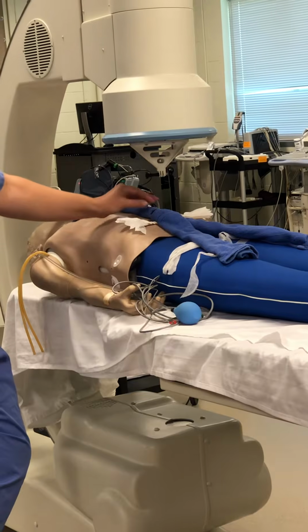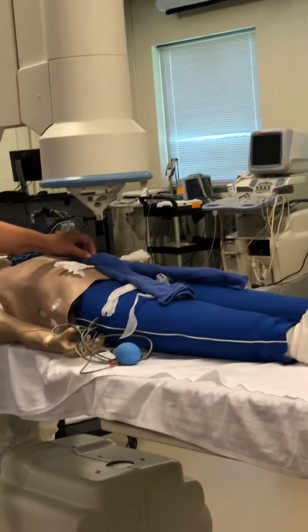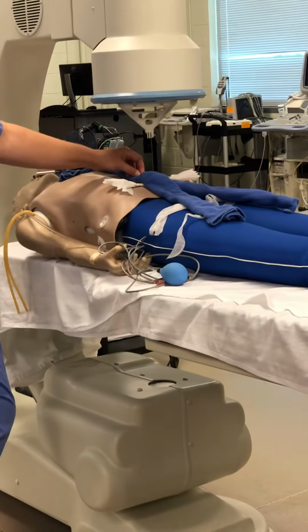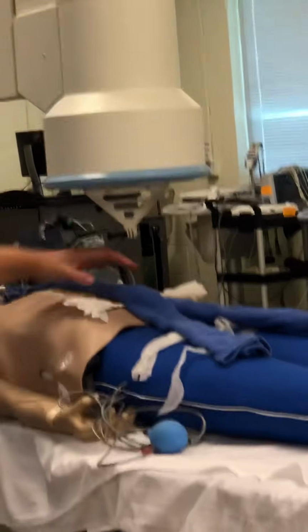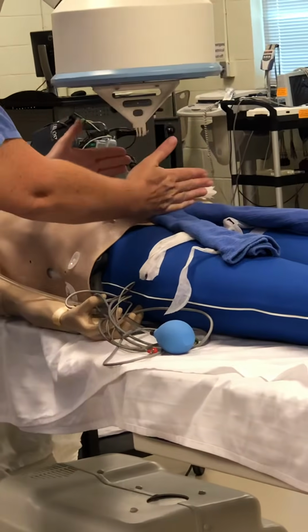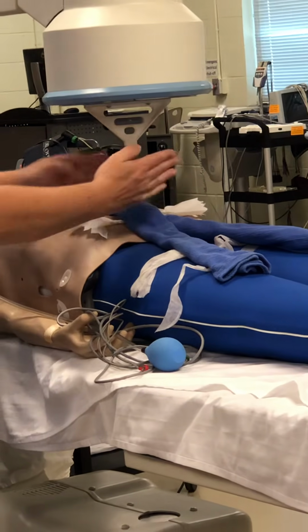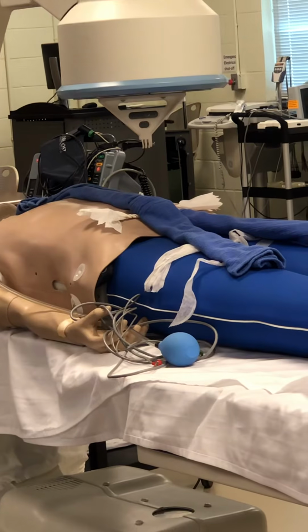Remember that this one is where we're going to put the pigtail above the renal arteries, and we're going to do the power injector with 15 for 2 or 20 for 2 to look at the takeoff and look at the aorta from about here to here. Okay, we want to center so that our renal arteries, we see those nicely on both sides like the images that we saw today.